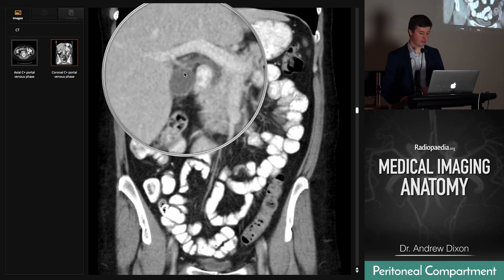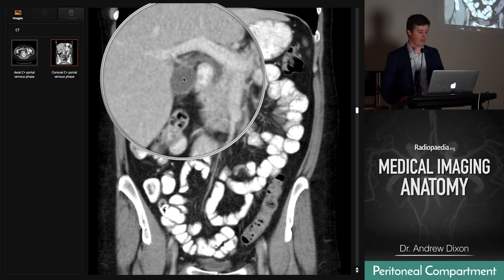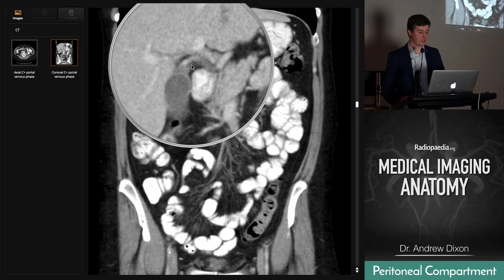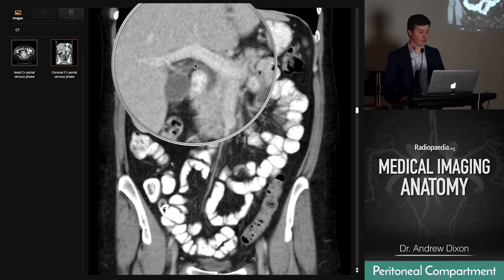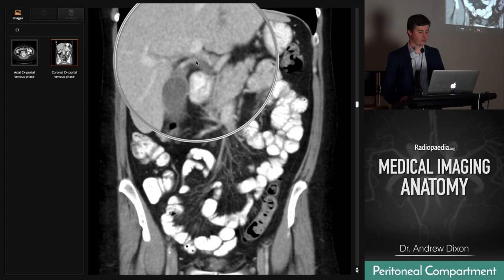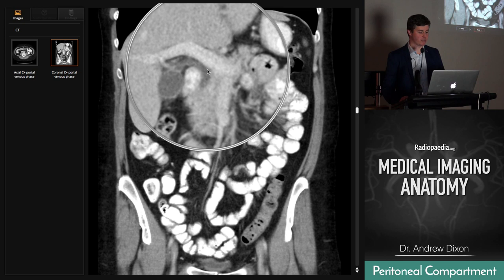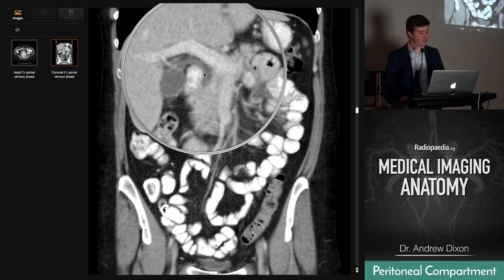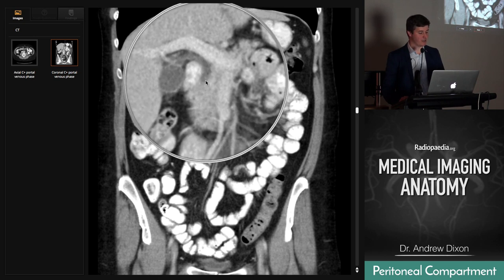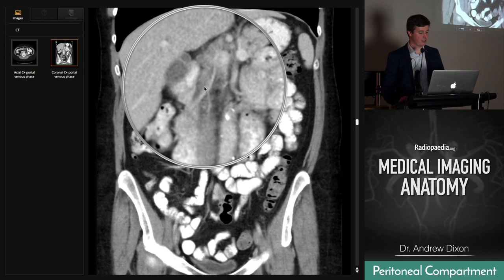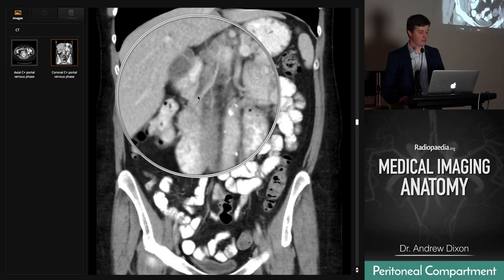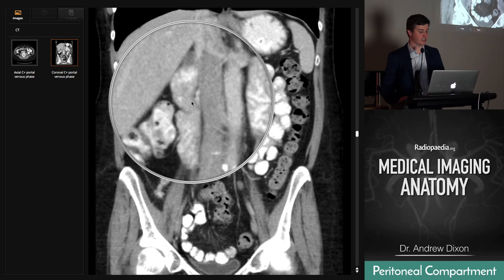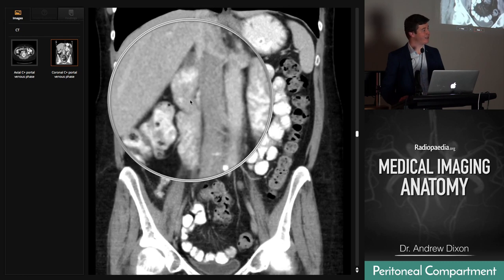On the coronal images: the gallbladder, the cystic duct joining into the common hepatic duct to form the common bile duct, running behind the first part of the duodenum and then down in the pancreatic head into the duodenum around about there.